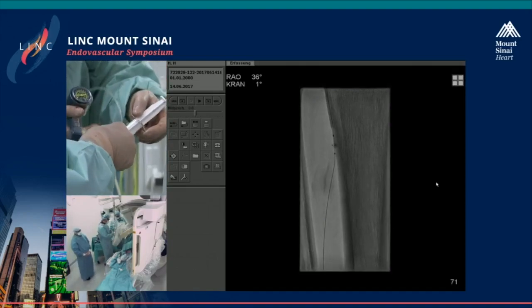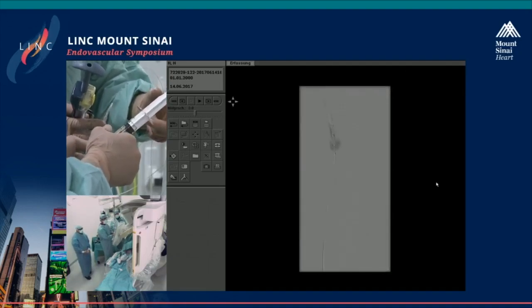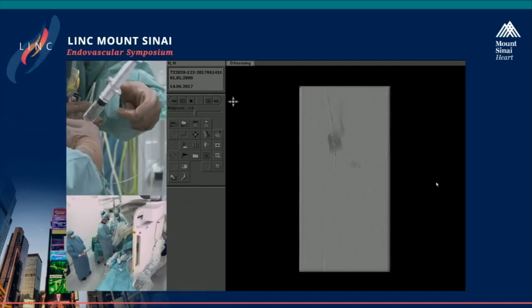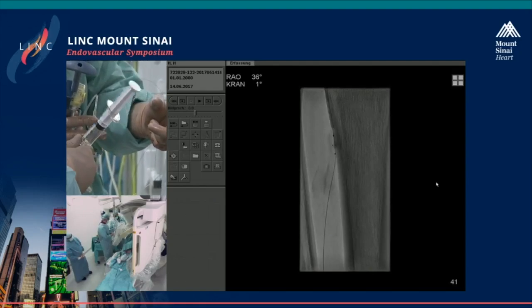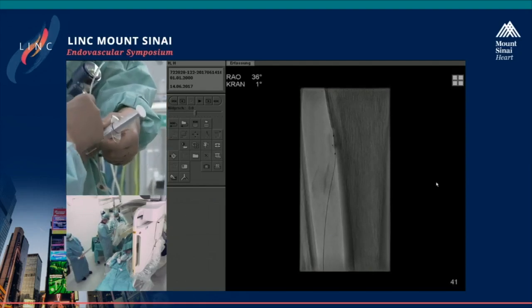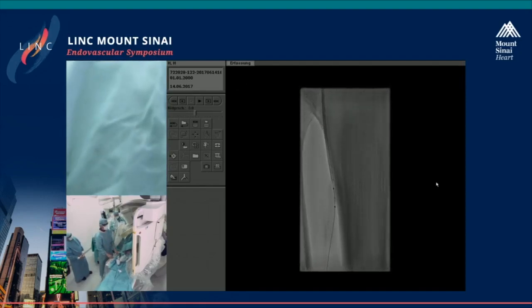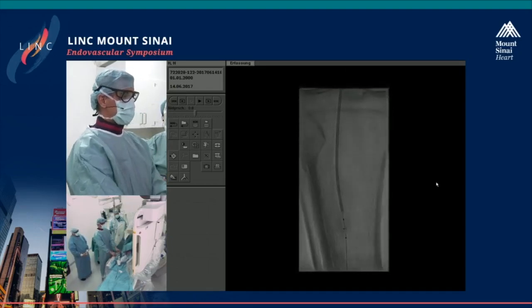Yeah. So I'm sure for somebody who sees that for the first time, it's a bit scary to see. I mean, we must say that in our experience, it has always proven to be a very safe technique. I don't know if somebody wants to share his experience from the panel. George? I think it's pretty safe. I've never had any perforation or significant fistula from it.